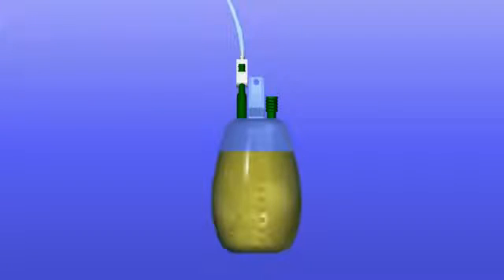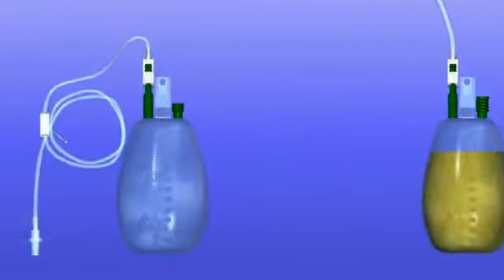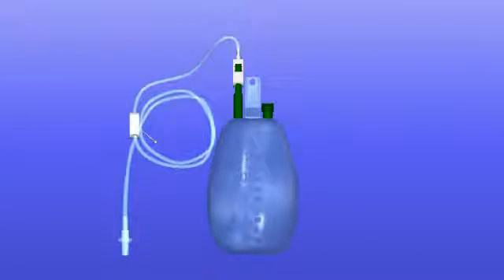If you feel shortness of breath, or if the bottles appear to be filled with more than 2/3 of fluid, all the fluid may not have drained. Use a second bottle kit if advised by your physician to do so, or contact your doctor or nurse.